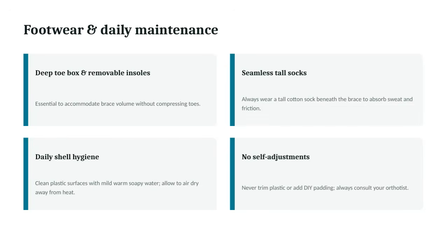When it comes to footwear and daily maintenance, choosing a deep toe box and removable insoles is crucial. This design is essential because it accommodates the brace volume without compressing your toes, ensuring comfort throughout the day. Wearing seamless tall socks is equally important. Always opt for a tall cotton sock beneath the brace to absorb sweat and reduce friction, preventing skin irritation.